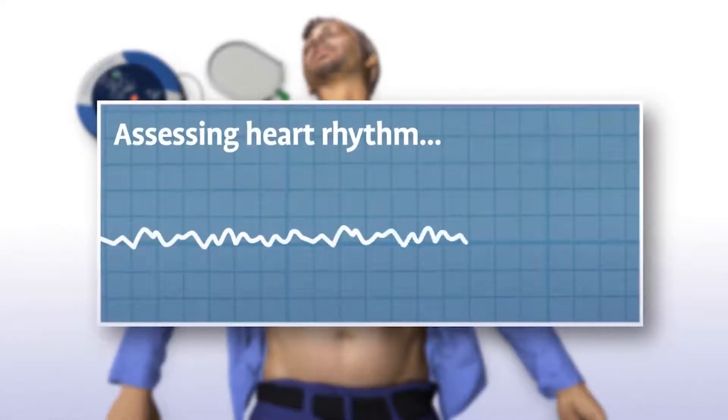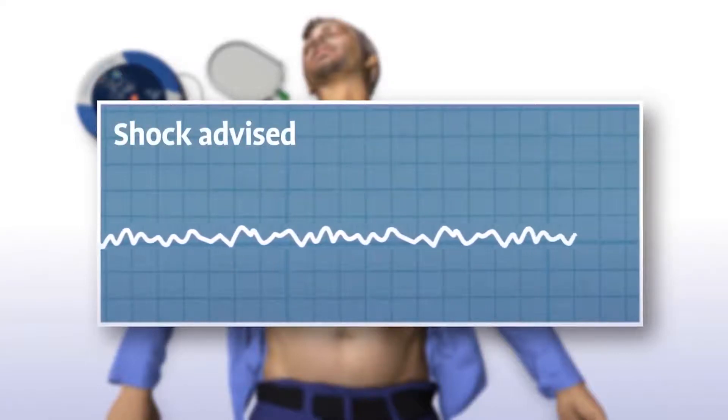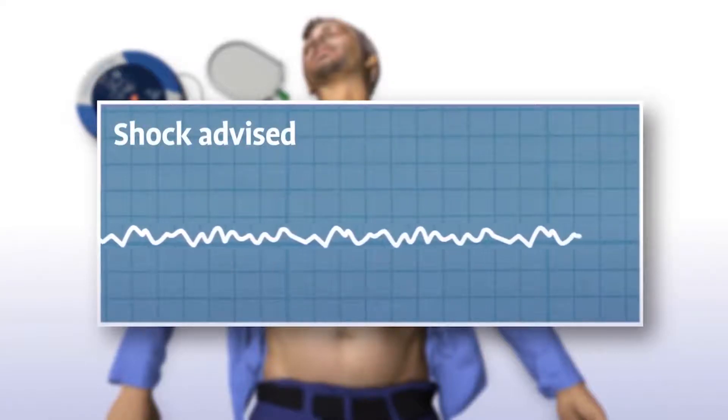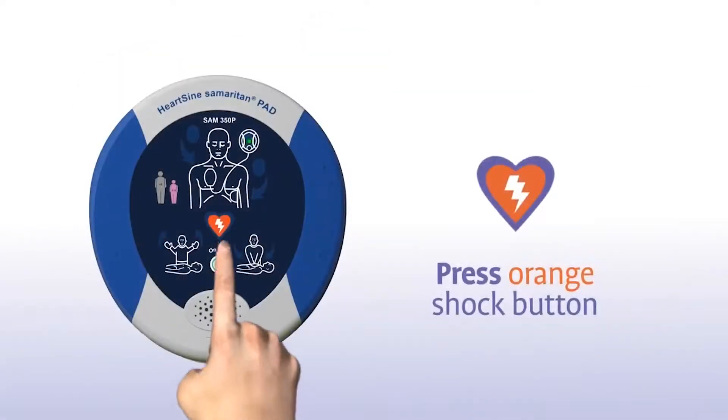The Samaritan PAD automatically assesses the patient's heart rhythm. Assessing heart rhythm — do not touch the patient. It then recommends whether or not a shock should be delivered. Shock advised. Stand clear of the patient.